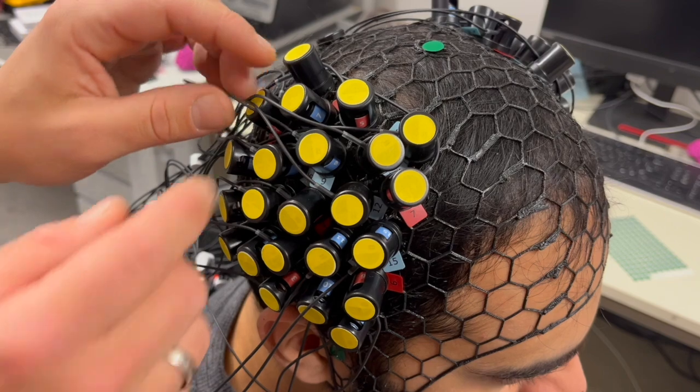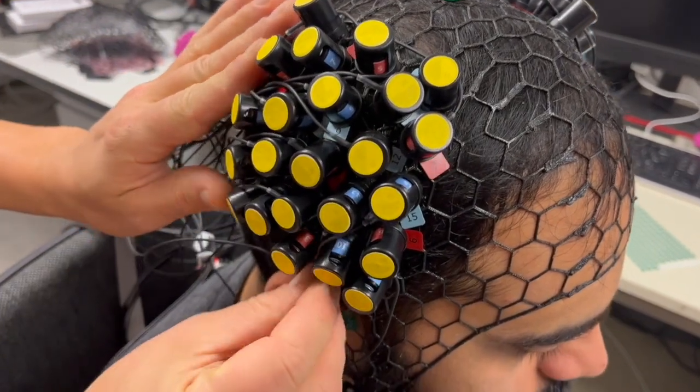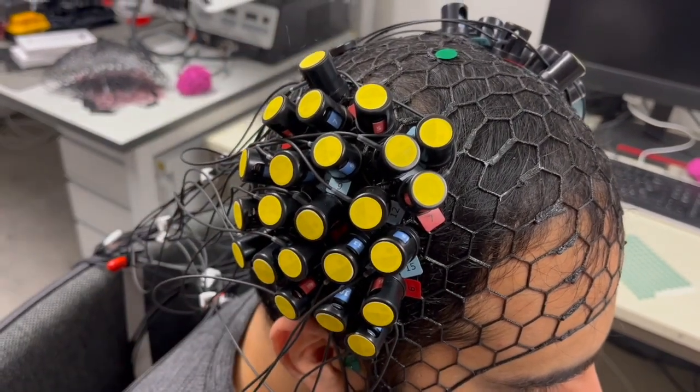Next point, cable management, very important. We try to avoid having cables in front of our optodes or in the way of our scan. And maybe also check if the optodes are sitting orthogonal to the head surface.